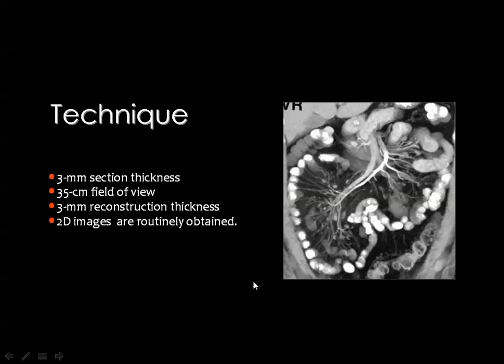You know that for imaging of the peritoneum and mesenteric lesions, we may use different imaging modalities, including ultrasound, CT, and MRI. In my opinion, CT is now the modality of choice for evaluation of peritoneal and mesenteric diseases. And this is the suggested technique whenever you are dealing with some of these pathologies.